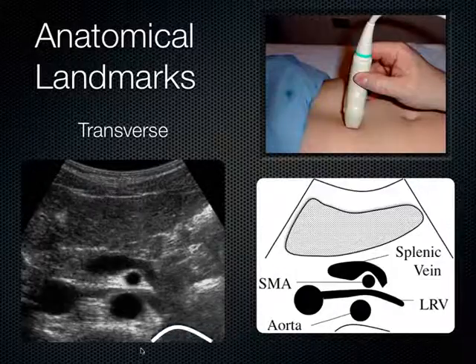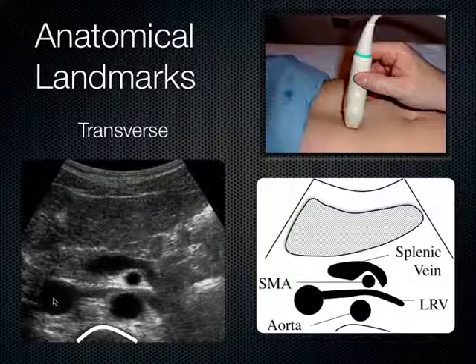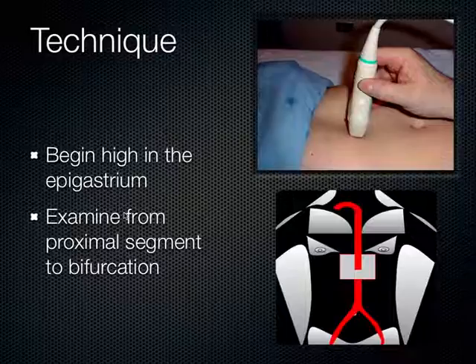One more time. Spine shadow. What's this? Aorta. What's this? IVC. What's this? SMA. Looks like a mantle clock. What gets nut cracked between the aorta and the SMA, draining into the IVC? Left renal vein. What vessel crawls over the SMA? Splenic vein. This is all the pancreas and then the liver.